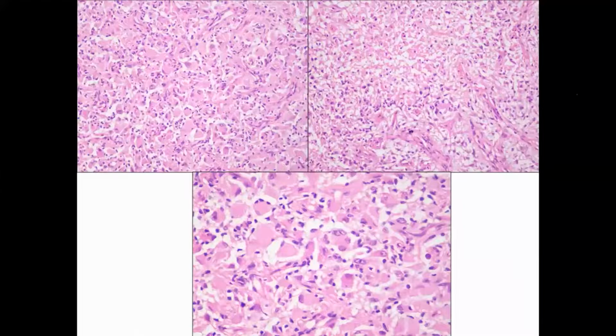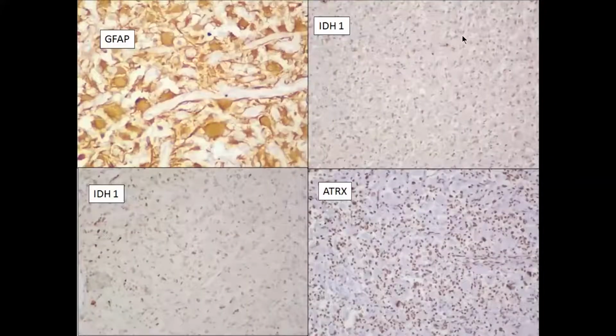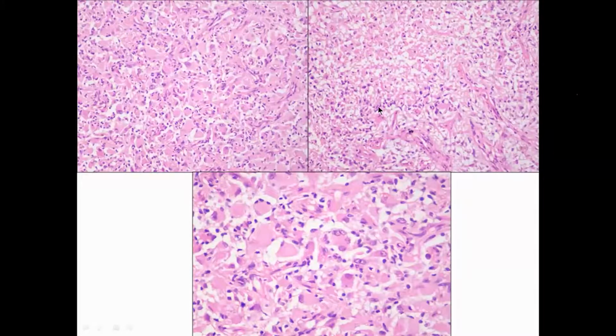So very typical of this morphology, the balloon-like cells with hyalinized cytoplasm. This reminds me of the ground glass hepatocyte in the liver. So these are gemistocytes, with abundant globoid, pinkish, hyalinized cytoplasm and eccentrically placed nuclei. We can see these branching vessels. Some of them are showing proliferation and central zonal necrosis. But here also we can appreciate some palisading of these tumor cells, a rim of tumor cells surrounding this necrotic area.